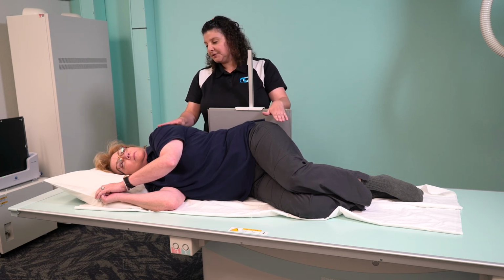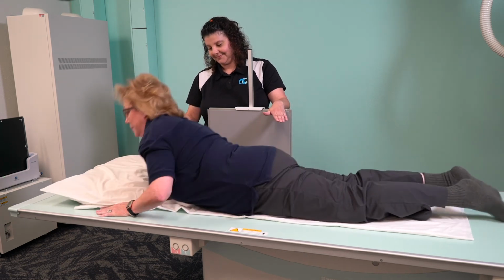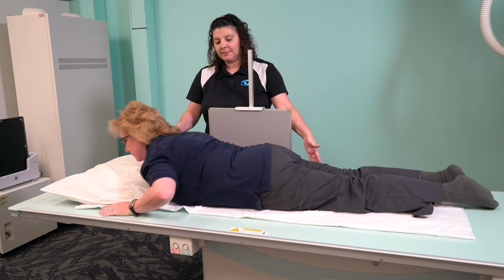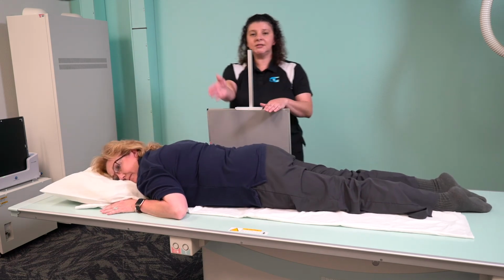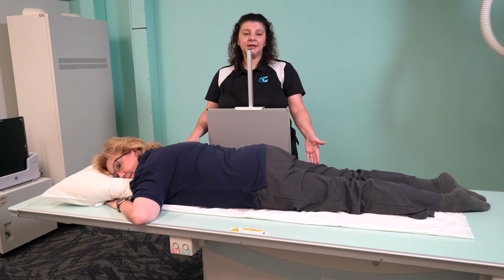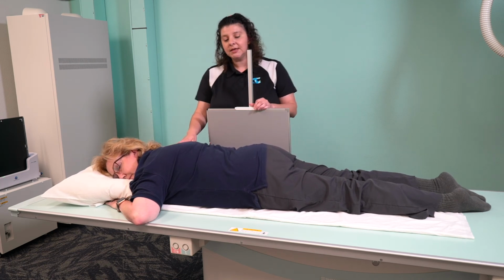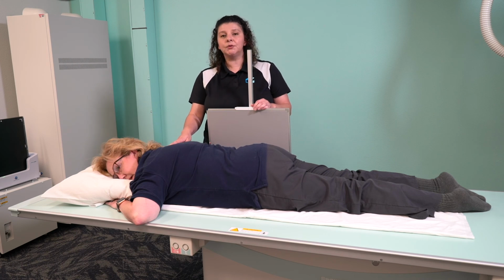Now if you'll lay back onto your stomach. I'm going to maintain my central ray horizontal and my image receptor perpendicular, but now she's on her stomach, so she's prone. Because my central ray is horizontal, this is going to be a ventral decubitus.